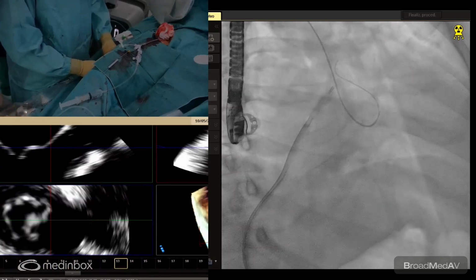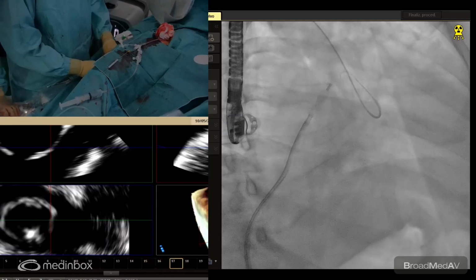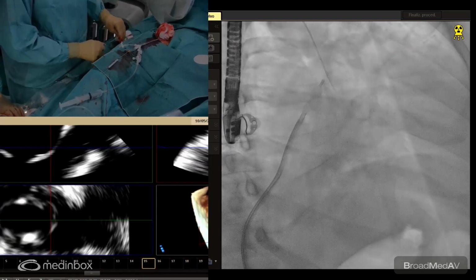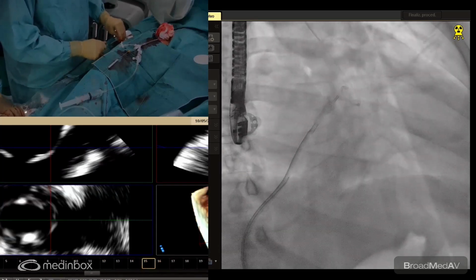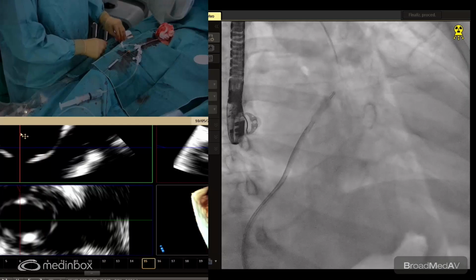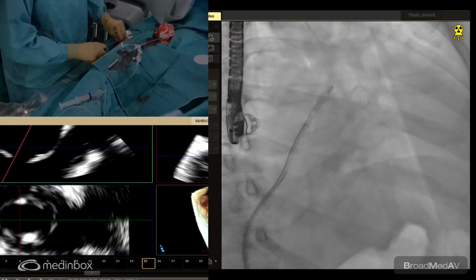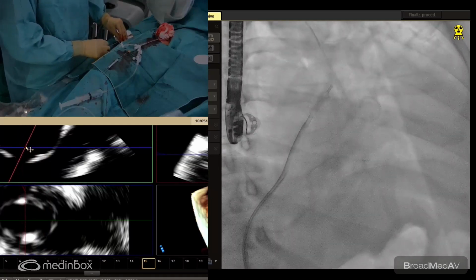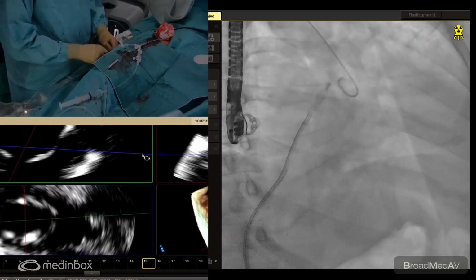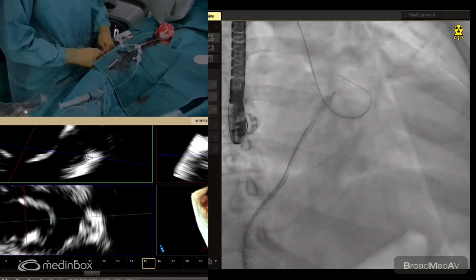I'm here. But if we are not able, after Silvia measures everything, my mentor checked the result with the cardiac auscultation. The real cardiologist, not us, with all these gadgets.